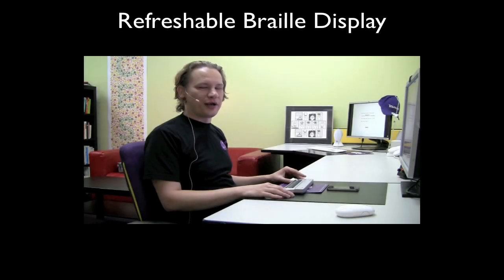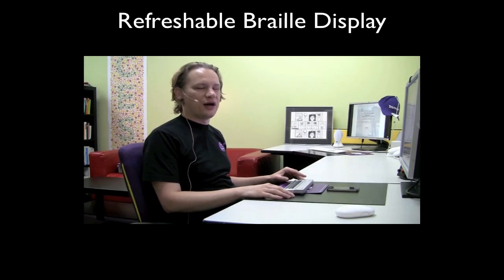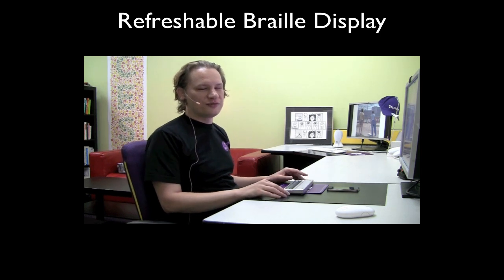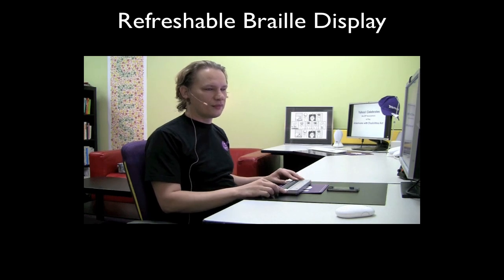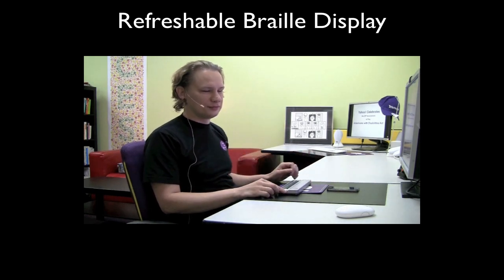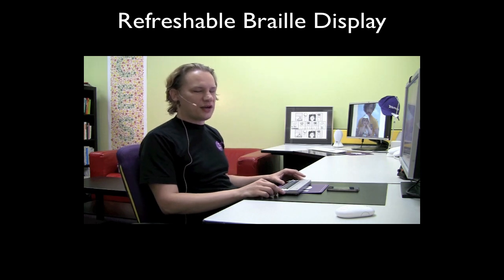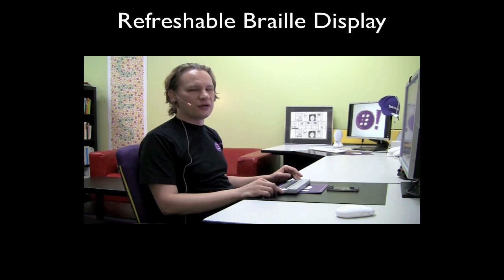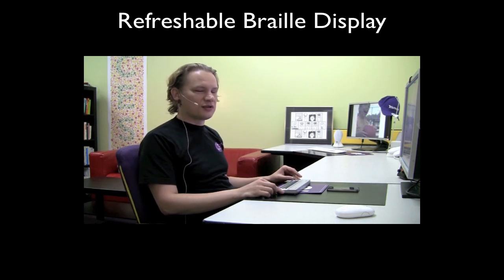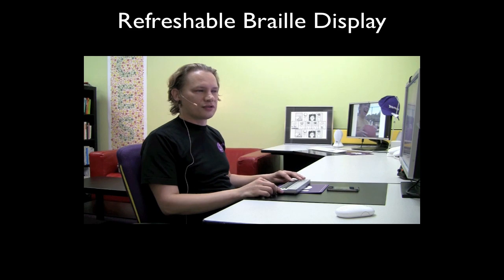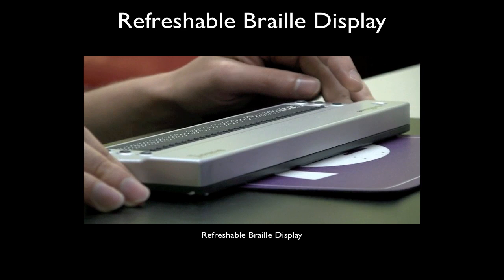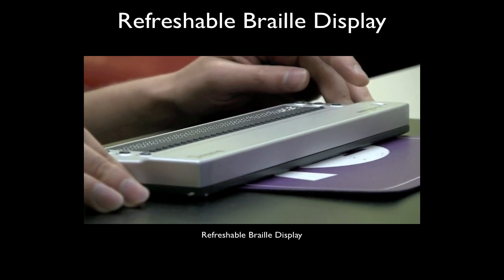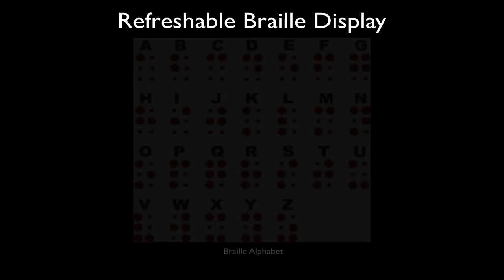Hi, I'm here to tell you about Braille Display and Apple iPhone 4 and how these two devices can work together. This is Braille Display and this is the iPhone. I've connected Braille Display via Bluetooth to the iPhone and I will be driving the iPhone without ever touching its screen. Braille Display is a device that communicates the text on the screen — in this case the iPhone screen — via the alphabet known as Braille.